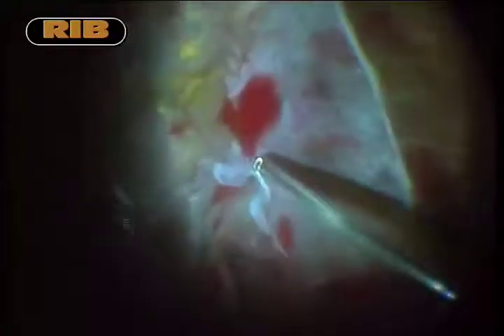The narrowness of the MIVS cutter and the presence of its cutting port close to the tip allow us to explore narrow, tight spaces close to the retina. Alcon's Constellation vitrectomy system, with its advanced illumination and fluidics, further aids in the surgery.